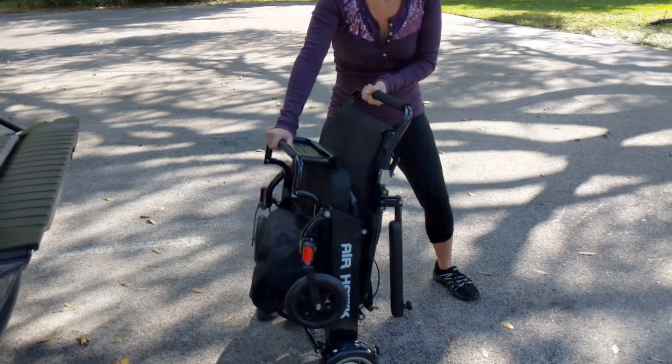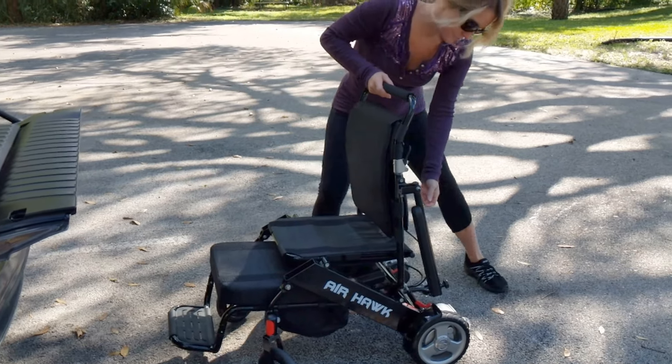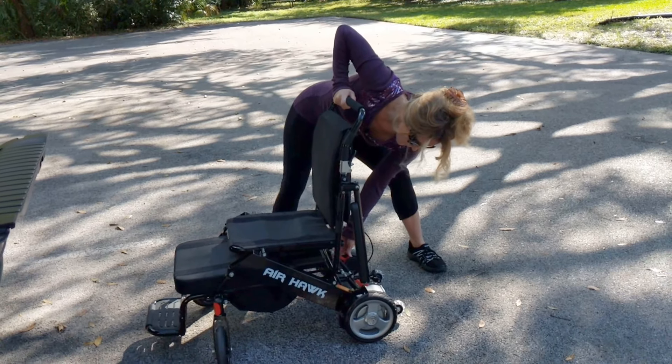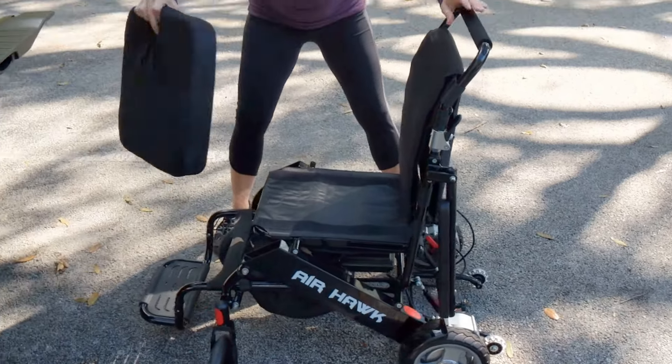We're going to very easily unfold that chair — takes but a couple seconds. The chair has a safety mechanism to latch the chair into place, and now we're actually locking the motors in place, making that a power chair.